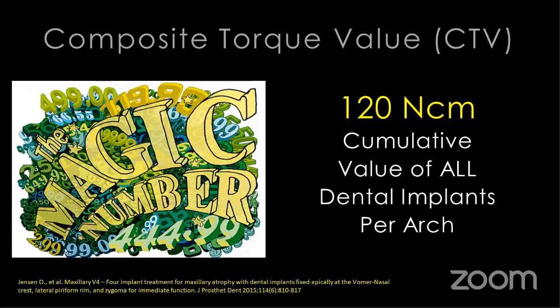So in the past, before we were doing pterygoid implants or zygomatic implants in the office, if we had cases that had very soft, inadequate bone, if we did not have very good insertion torque value, then how we dealt with it at that point in time was to just place additional implants because we were trying to increase this composite torque value. So the more implants we have, the more bone to implant contact we have, the closer we can get to this 120 Newton centimeter torque value. Now with pterygoid implants, with zygomatic implants, we can very quickly reach this 120 Newton centimeter torque value because this bone is so very, very dense.